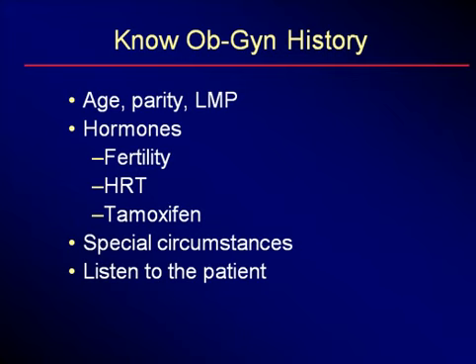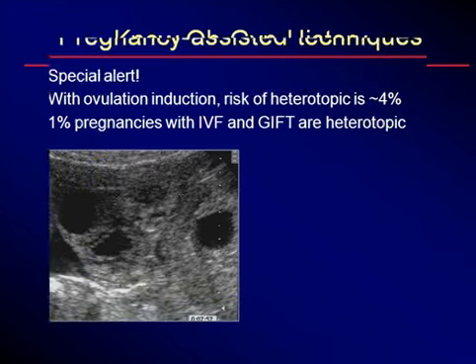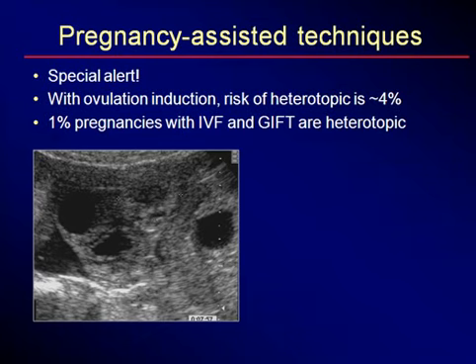Ultrasound is one of these areas where we actually do still have patient contact, and while we're scanning, we can hear more detail about the patient's condition and look for the abnormality actively.